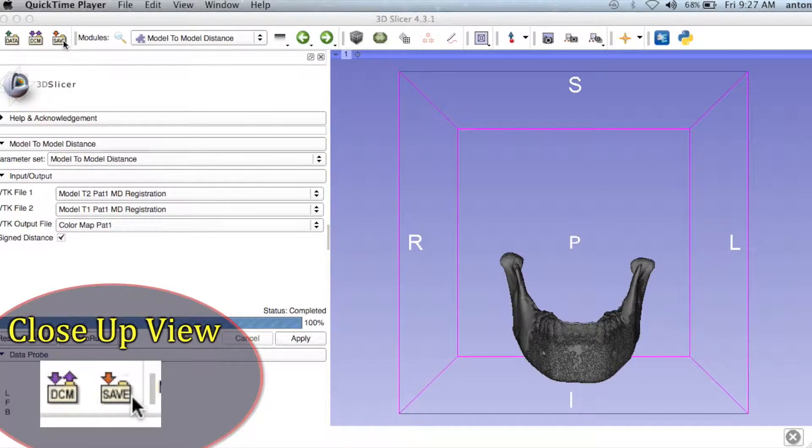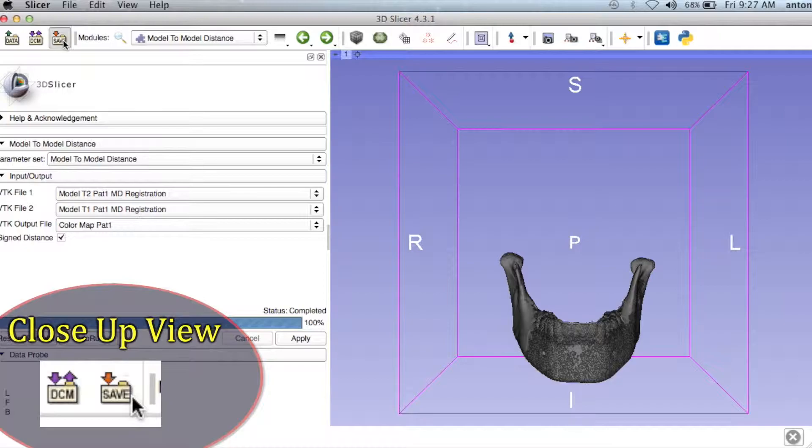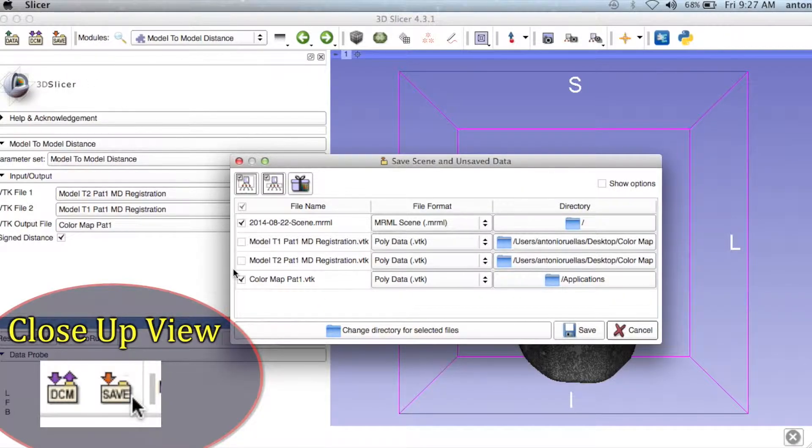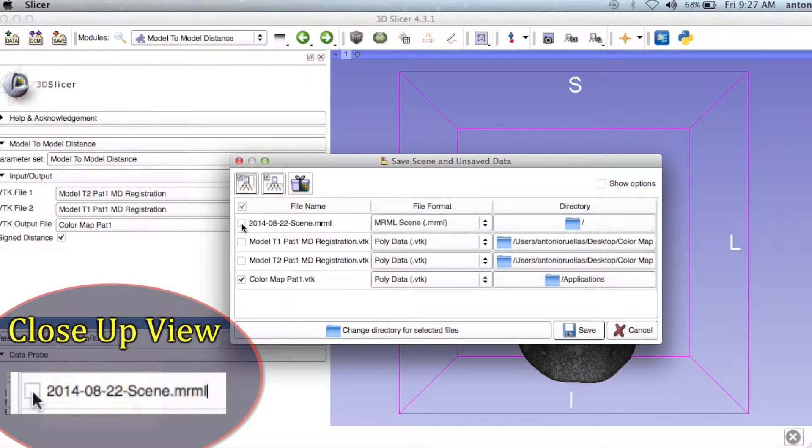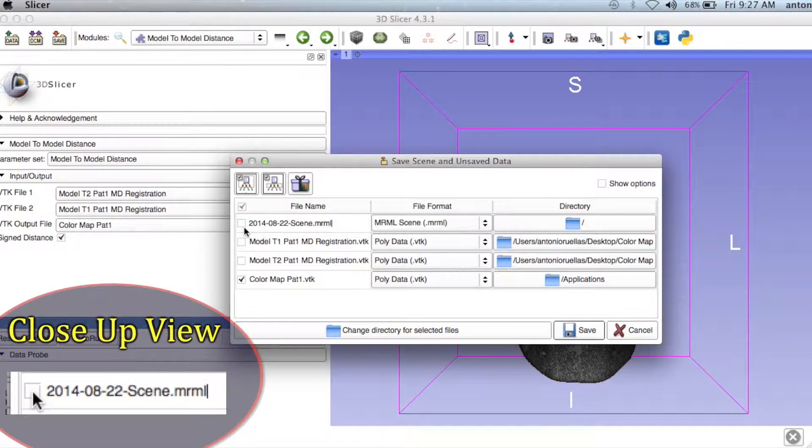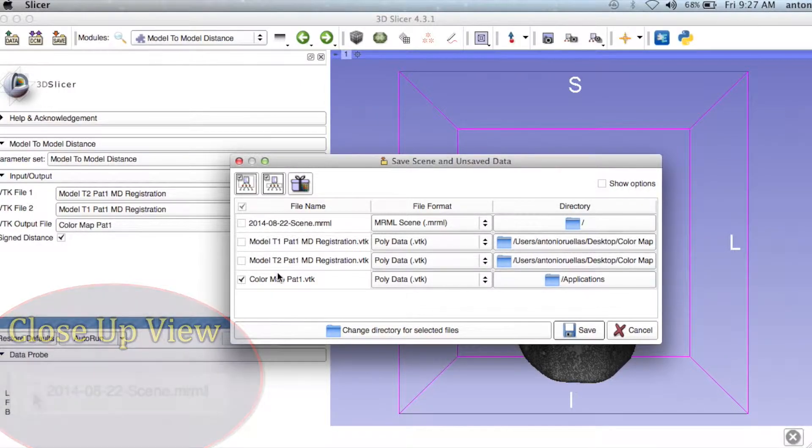Once it's completed, go ahead and save the color map by clicking the Save icon. In the window that pops up, it's not necessary to save the scene file, so go ahead and uncheck it.